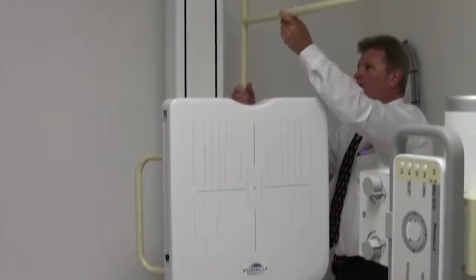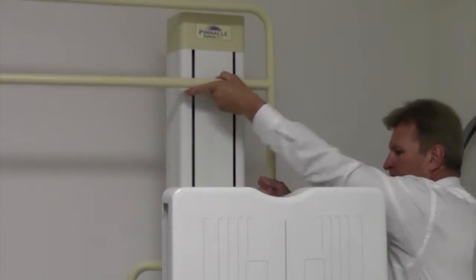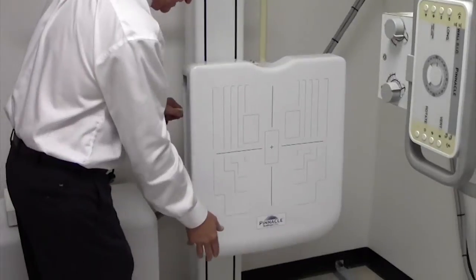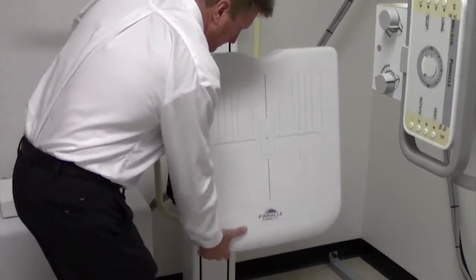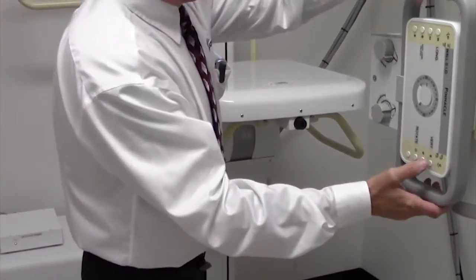The patient assist bar can be easily rotated around and out of the way to do a hand x-ray or lower extremity. The tilting mechanism comes up.